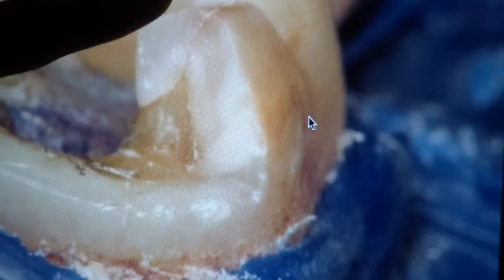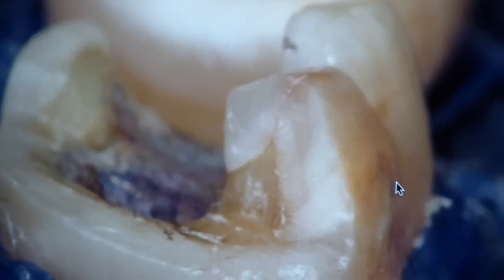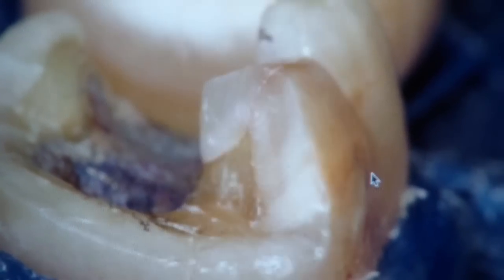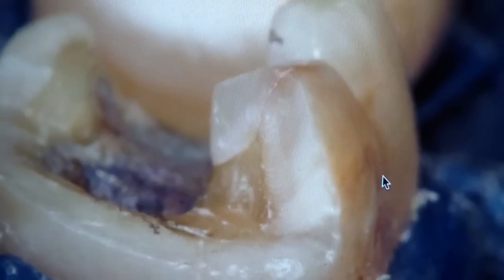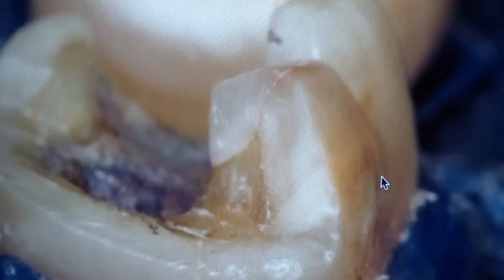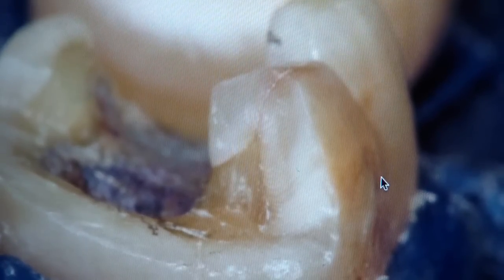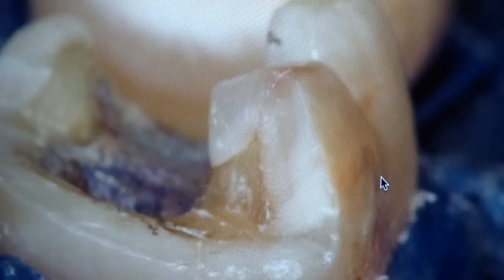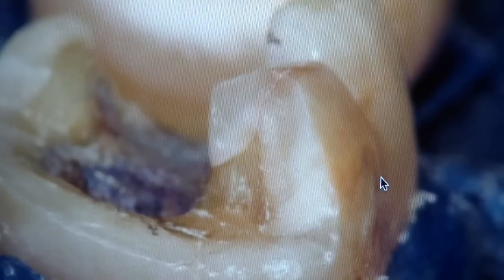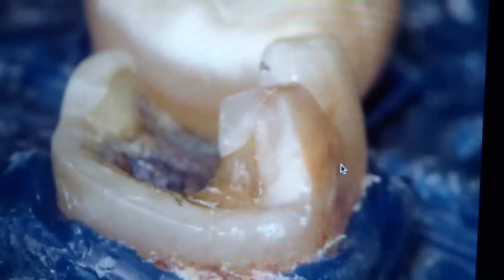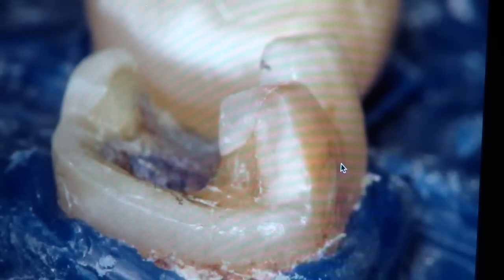But what do you think about this line here in the cuspal area — is that a fracture line? Hard to say. Developmental? I cannot tell. It could be just a craze line in the enamel. All right, thanks for your time. Thank you.